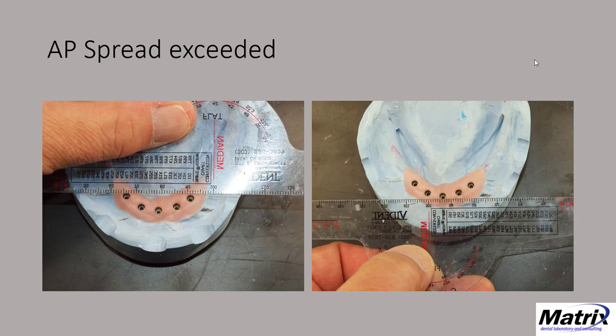And if you're not sure about AP spread or the rules, there are some basic rules, and that is you take a measurement from the front of the implant, depending on the configuration. If there were only 4, then you would take obviously the measurement between the top of the anterior 2, and then you take a measurement back here on the terminal implants, and that distance between the front and the back times 1.5 is basically where the terminus of the implant supported bar should exist.